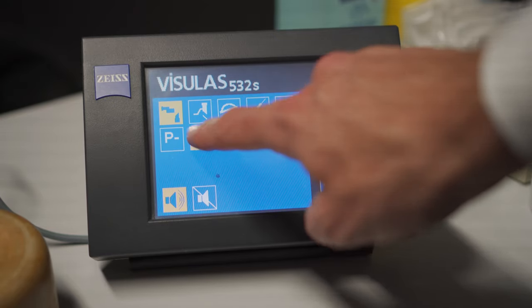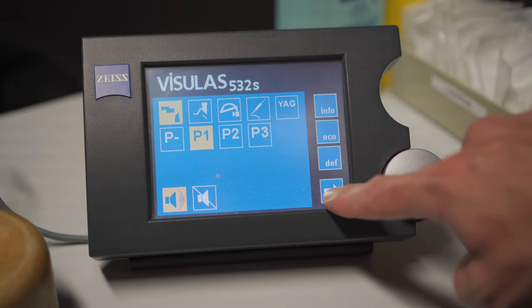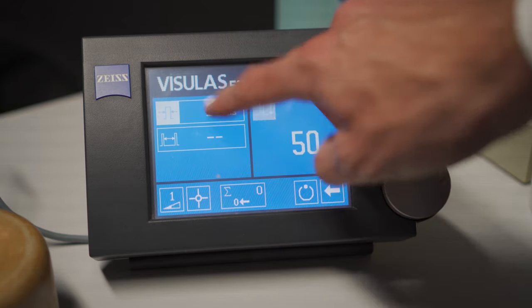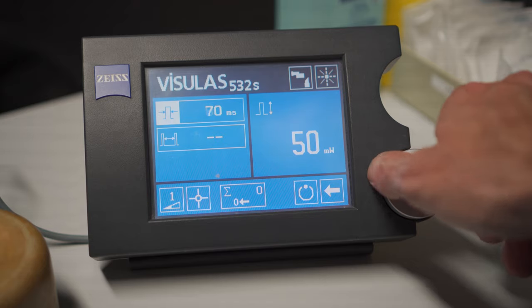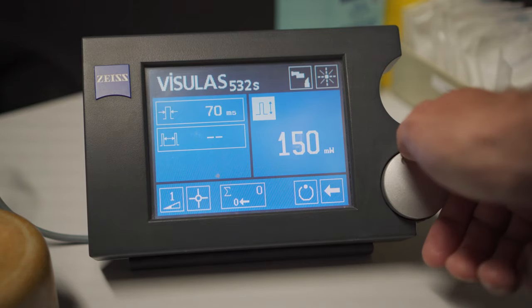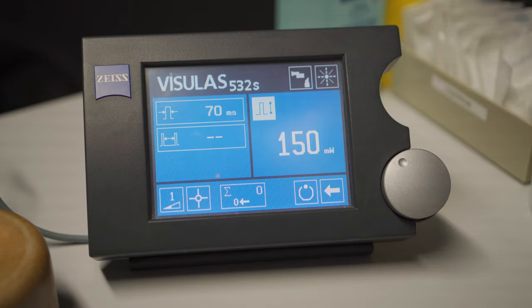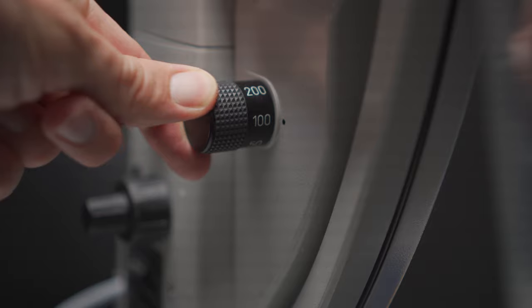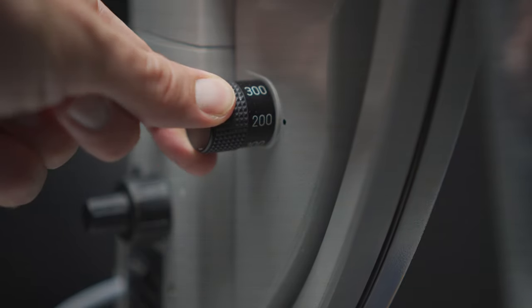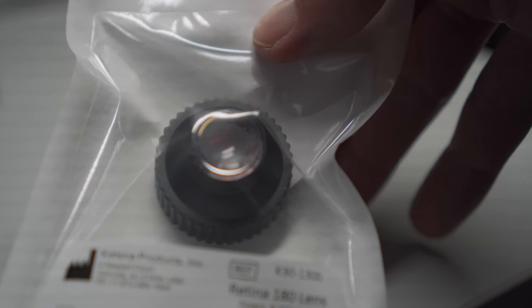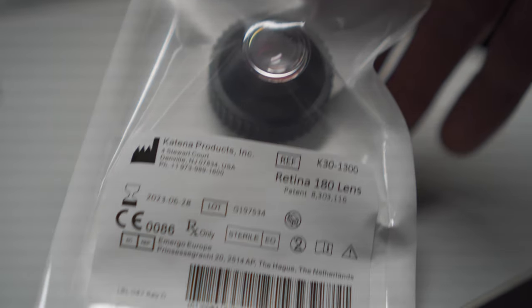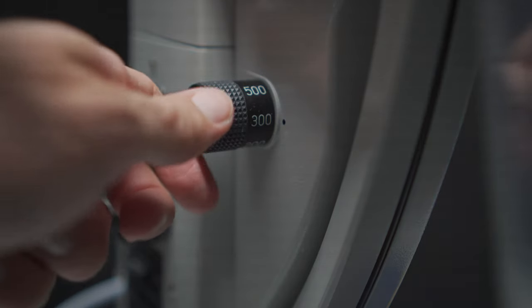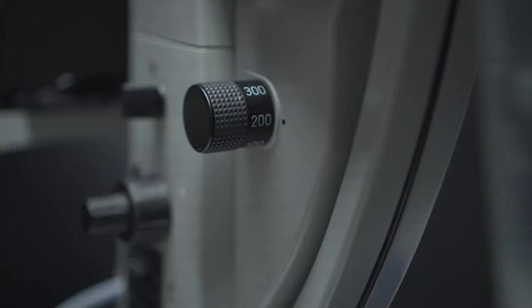For the moment, I will just give you a little quick start guide on what settings I usually use. I usually like to start with 70 milliseconds and 150 milliwatts. The spot size depends on your contact lens. I usually use the Retina 180 lens at our clinic, which has a laser spot magnification of 1.25, so I start around 300 or 200 microns.